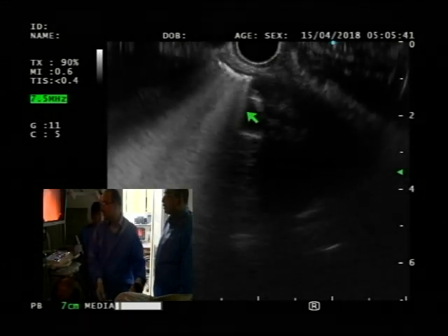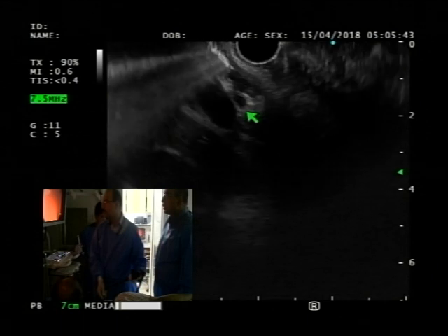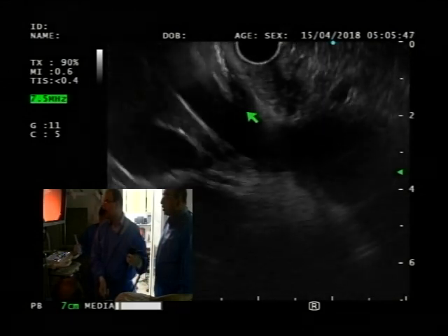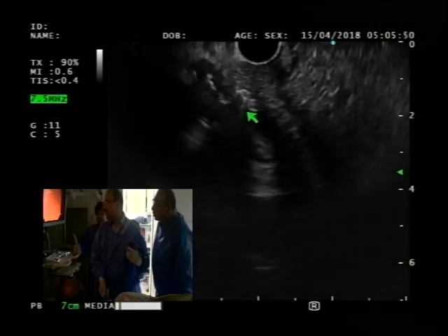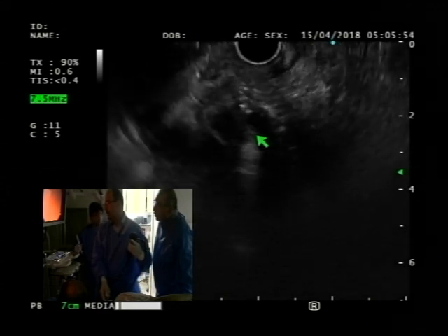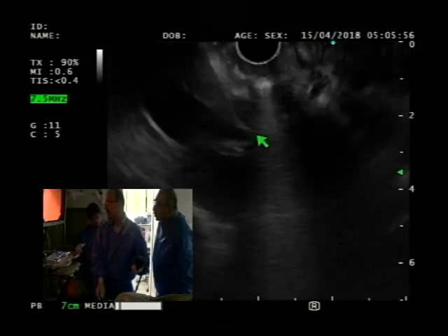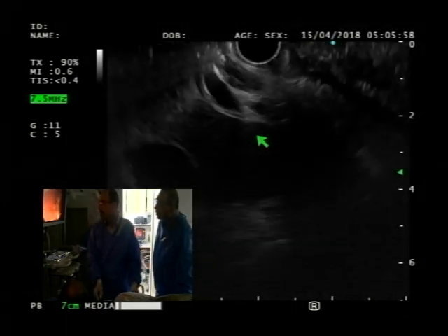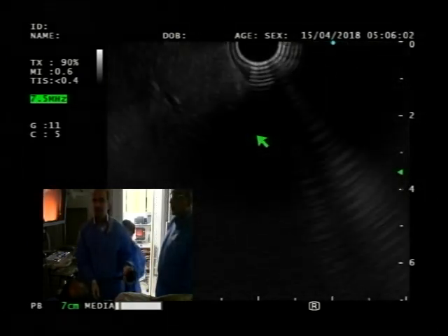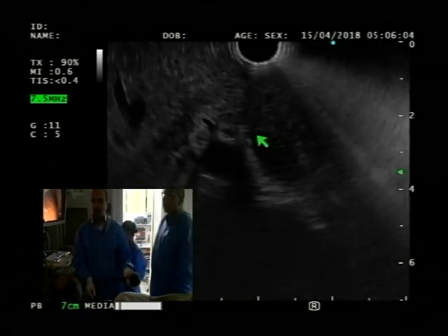and now I'm going to try and keep that as my central focal point, and follow it down towards the head of the pancreas. As I do that, the air might get in the way, but right here, this is the bile duct. We're following it down. In her, it's not as crisp as sometimes it is. But what I would suggest here is, just like you normally do in ERCP, go to the second portion.